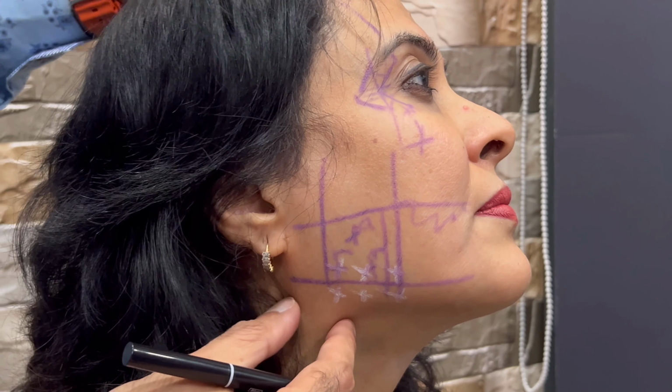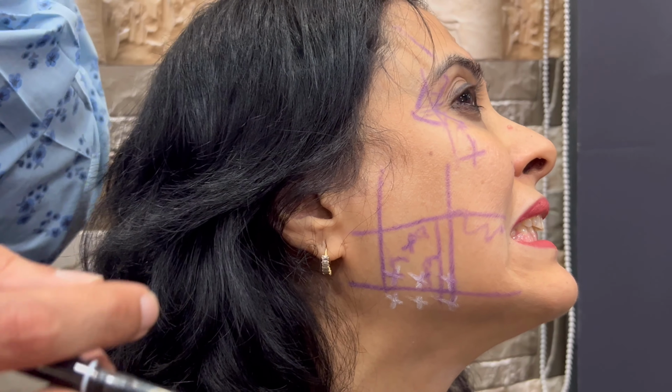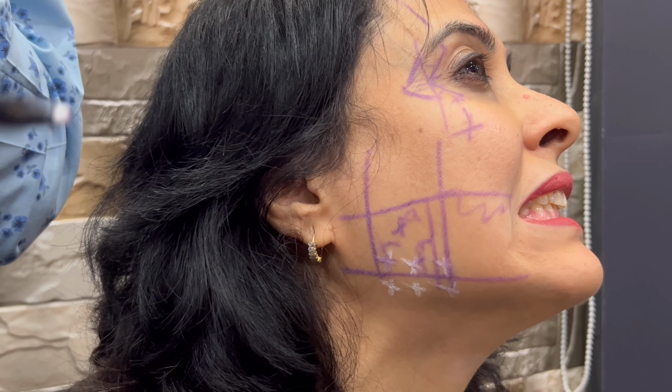Okay, and then look for the posterior platysmal band. Tighten. See if there is a posterior platysmal band. Here, there is a posterior platysmal band. Grab the band and put.